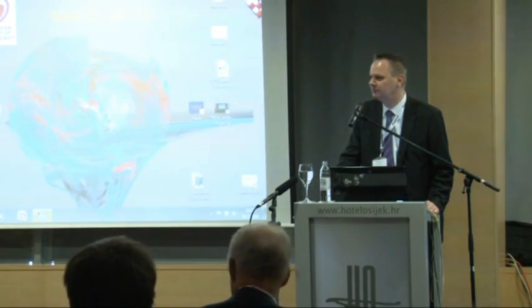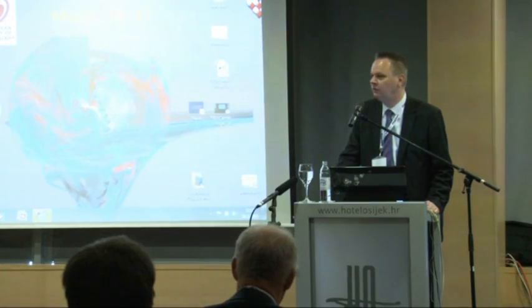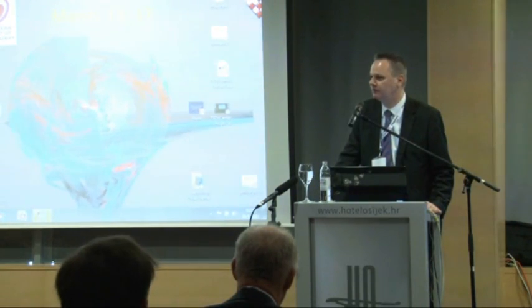And there is a recent paper on coronary spasm. They also investigate this. We are looking at the vascular restoration function by acetylcholine at follow-up, 2 to 3 years. Yeah, and then we look at whether the vessel is indeed restored or not. And you can identify patients at risk of spasm? Well, not at risk of spasm, but we look at whether the vascular function is restored. Spasm, that is not something we see often.